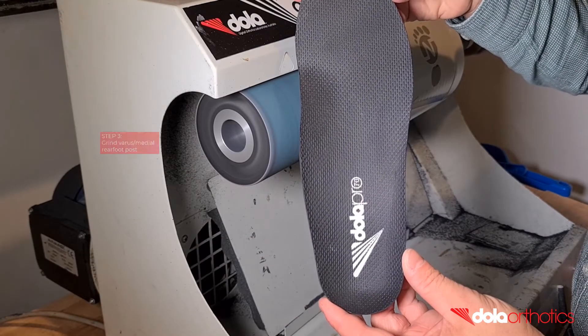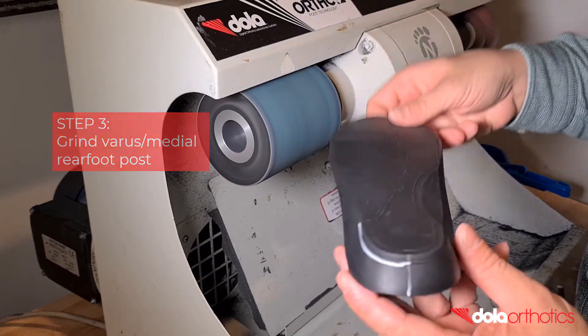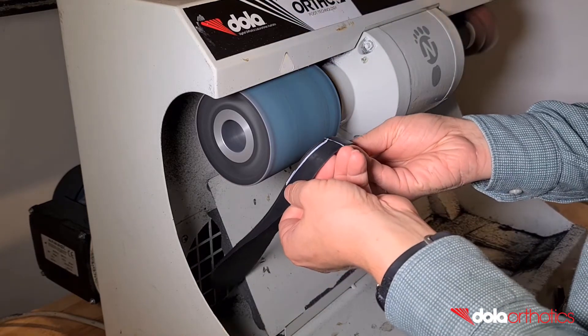The aim of grinding is to remove the orthotic shell material from the lateral heel up to your guideline, and blend it at a gradual angle to the medial side, leaving the medial border untouched.